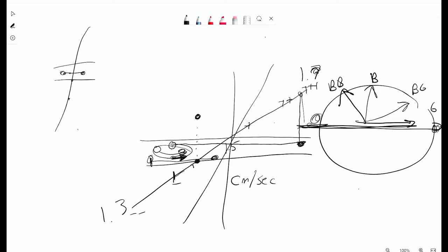as the pre. Right. Because typically you're going to have your pre, you're going to have your post, and you're going to have your visualization, so care bolus, fluoro trigger, care trigger. See what I did? Care trigger. So at that point, you want to make sure that this is always copied to the table position. Because if it's not, if you've moved it too far up or down, then you're going to see the contrast come in. You're going to hit go, and then the magnet's going to have to do a pre-scan.